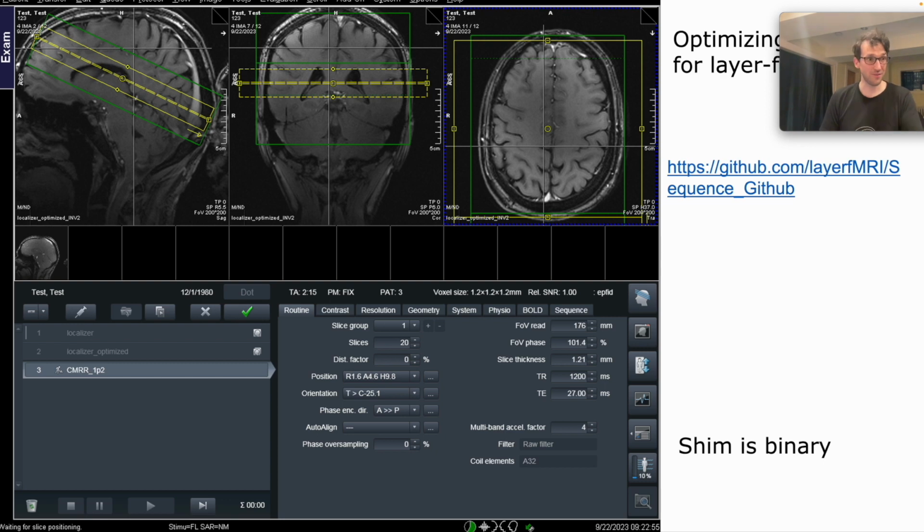And we have a lot of shim terms, usually third order shims. Those are a lot of spherical harmonics, and you cannot really fit third order spherical harmonics to 2-3 data points within your slab, right? So usually you need to have your shim box at a minimum thickness. Here it's slightly thicker than our imaging.